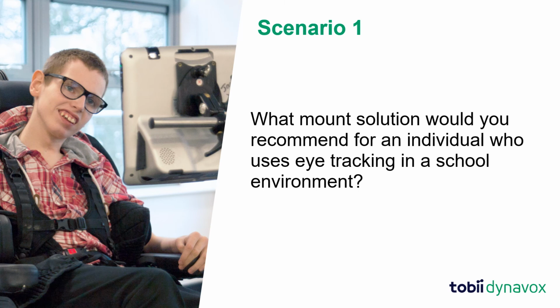Another question might be, what is the user's position? Is the child in a wheelchair? If so, a wheelchair mount will most likely be the best option. Is the child mobile and working at a regular desk? If so, perhaps a table mount is the best because they can then move classroom to classroom.